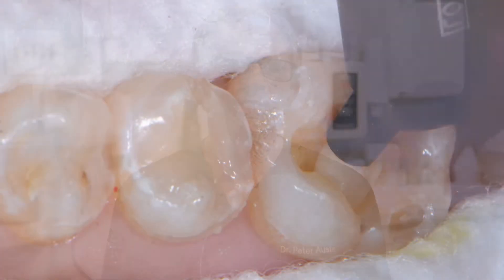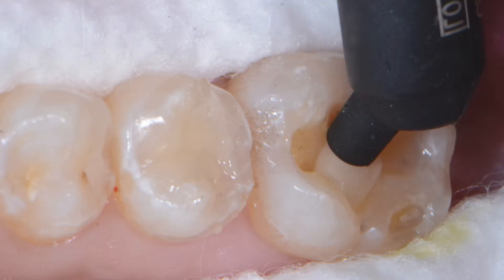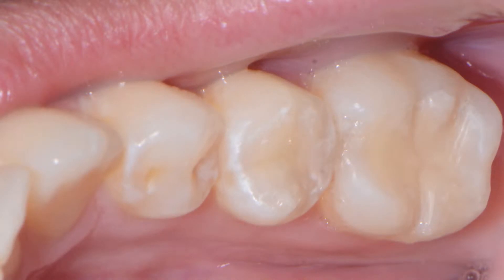I have to say that I've never been so excited about a dental material in most of my years in practice. Omnichroma is a very special product that makes you look good. It works with any shade of tooth, whether it's an A5 in the back of the mouth or a B1 in the front of the mouth. It matches everything, and that is incredible for you to see, and for your staff and your patients to see.